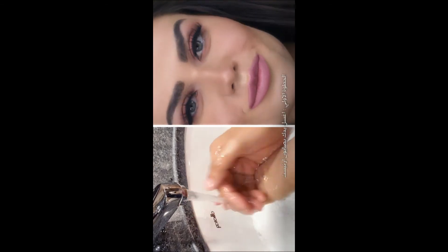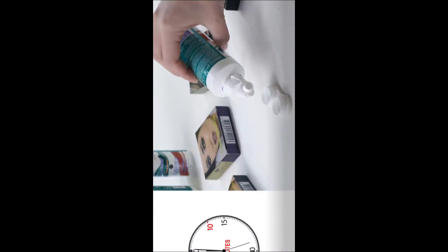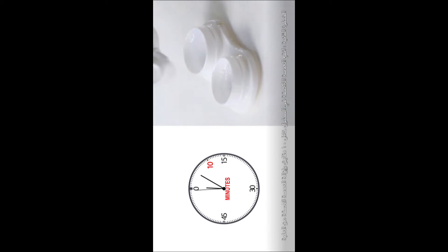Step 1: Wash your hands with Artista soap. Step 2: Soak the contact lenses with Artista solution for 10 minutes.